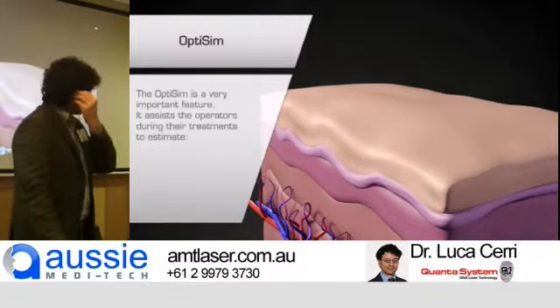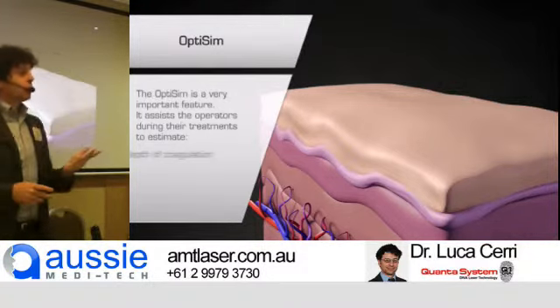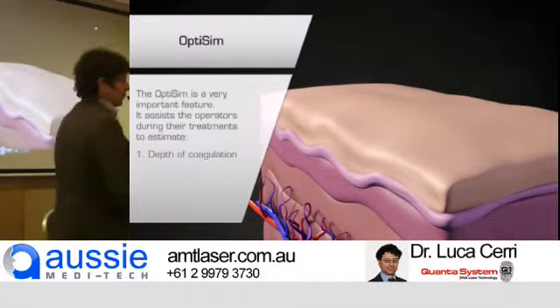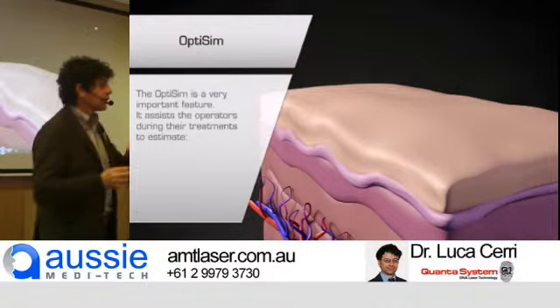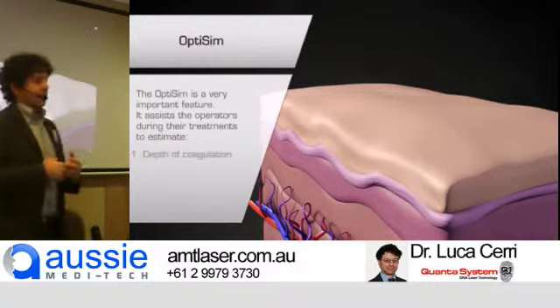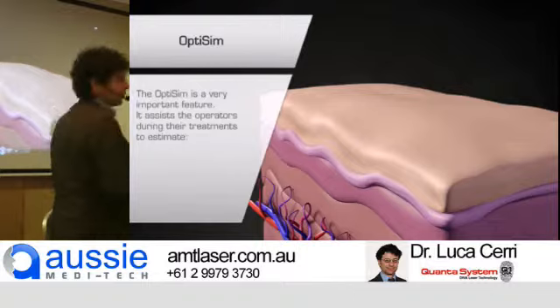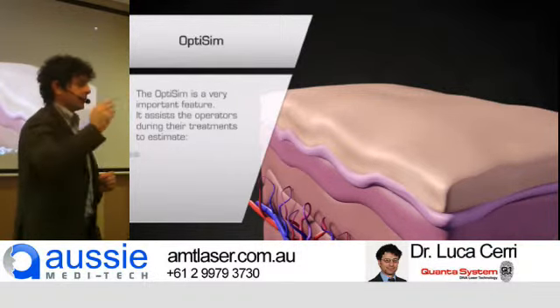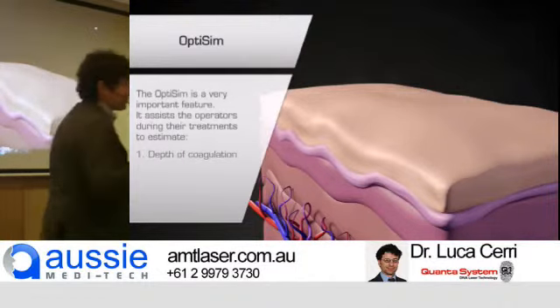For each setting, we want to know exactly how deep we are going with the two effects we have in the same treatment: coagulation made by the 1540 and ablation made with the CO2. And the third one, which is as important as the previous two, the treatment density. Because changing the setting of one laser, we are changing also the effect of the other one, and you cannot obviously go crazy trying to understand what is happening.